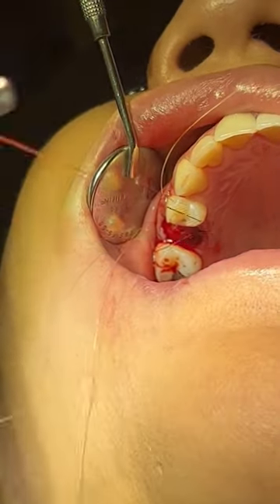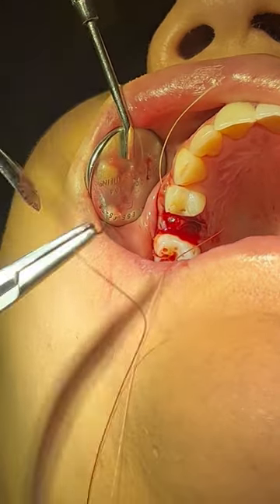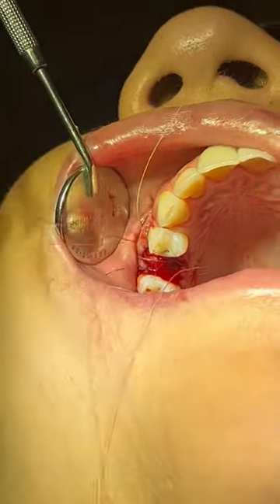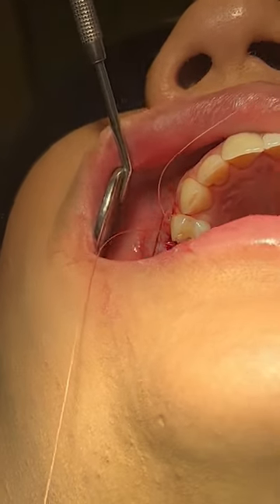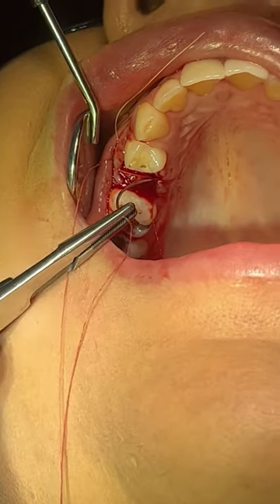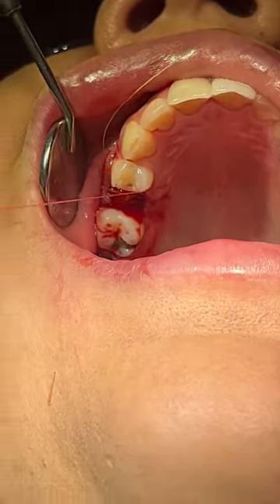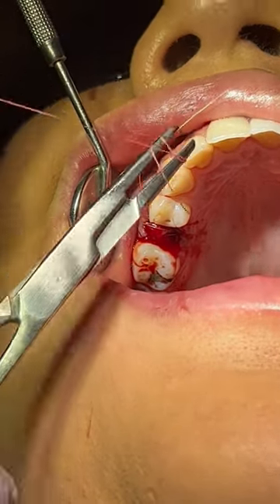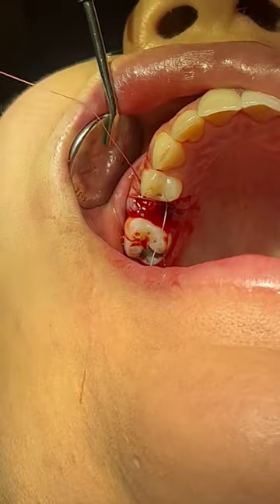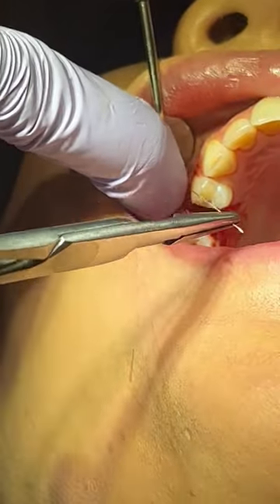Figure eight — that's what I like to do. I do a figure eight, but I actually add an additional suture in the middle aspect of the socket. I don't know why I do this; I've been doing it for so many years it's just become a habit. The figure eight will probably do just fine, but I like that security of placing another suture so that my membrane is going to stay there. I've actually been known to be the guy who places maybe more sutures than needed — at least according to some referring dentists. But it's okay; I'd rather do a little bit more.